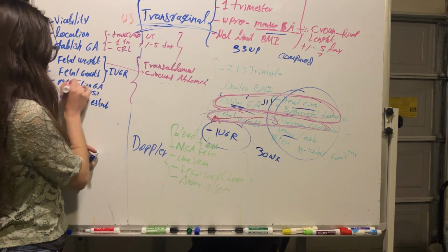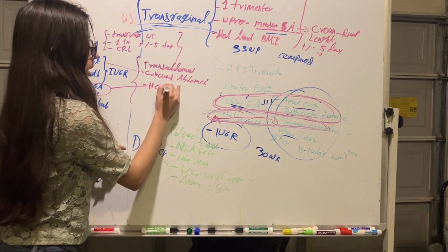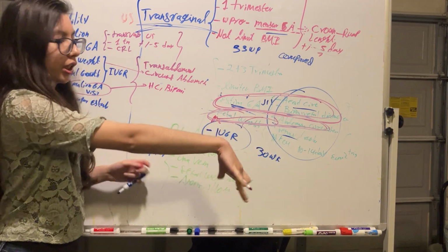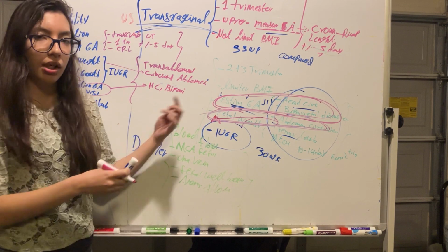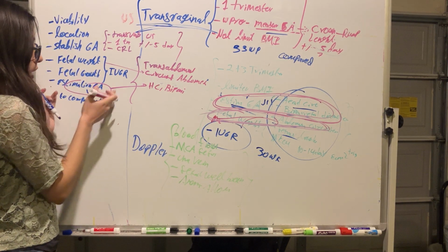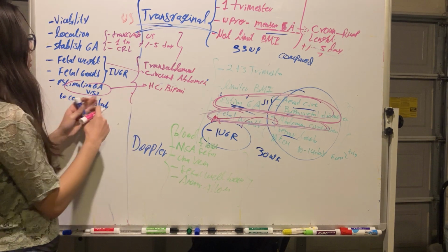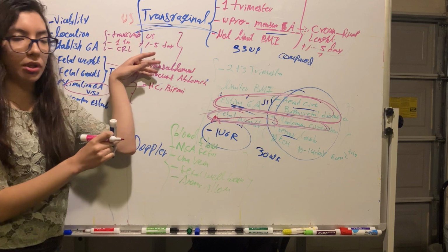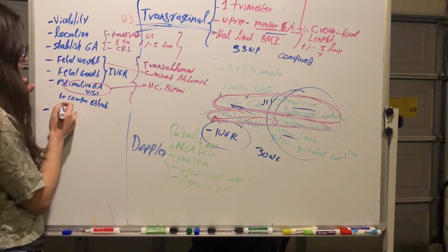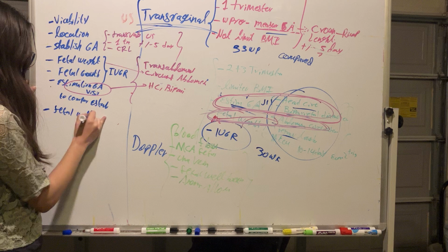This estimated gestational age is done with head circumference, biparietal diameter, abdominal circumference, and femoral length. Most importantly the biparietal diameter determines the estimation of the gestational age at this point. And this gestational age is going to be compared with the one established during the first trimester to evaluate for intrauterine growth restriction. Another indication is just to evaluate fetal well-being.